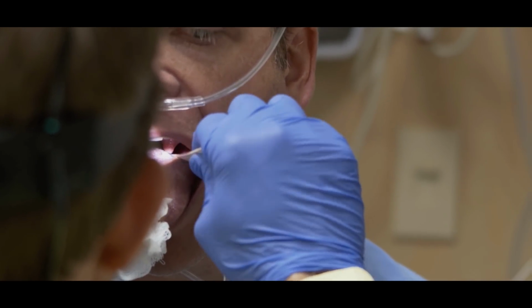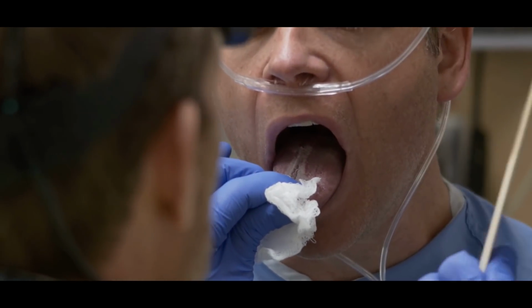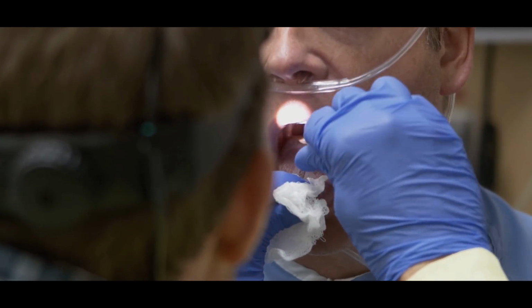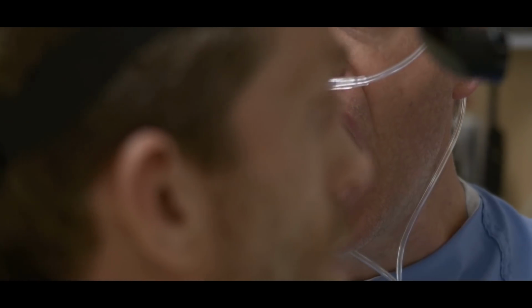And then if you can just hold that in as long as you can, and then when you have to spit it out, we'll spit it out. And how are we doing on time? How long have we been doing this procedure, Leanne? 10 minutes, 34 seconds. Okay.